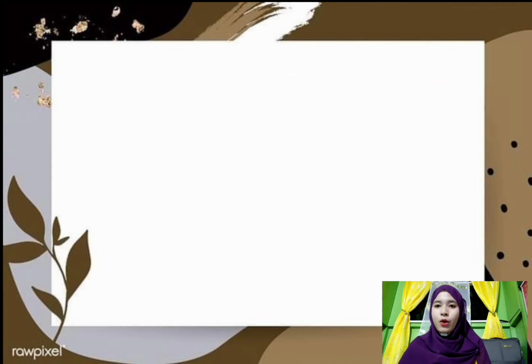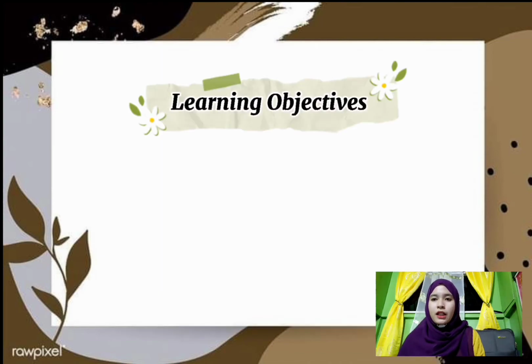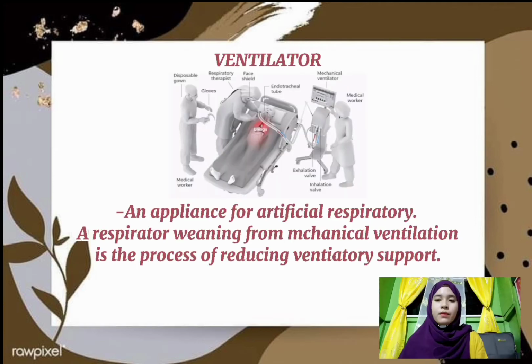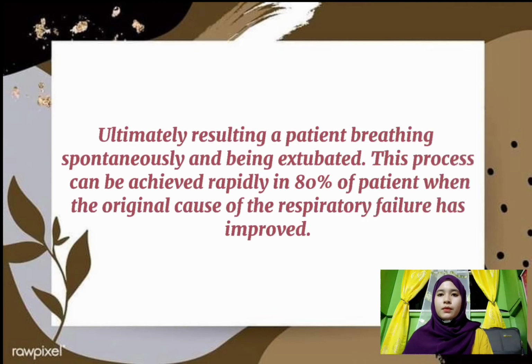Today, I'm going to report on weaning the patient from the ventilator. The learning objective is to describe the process of weaning the patient from mechanical ventilation. A ventilator is an appliance for artificial respiration. Weaning from mechanical ventilation is the process of reducing ventilatory support, ultimately resulting in a patient breathing spontaneously and being extubated.